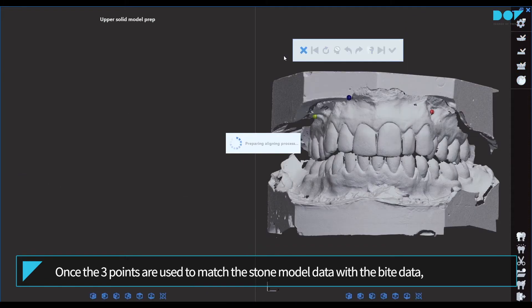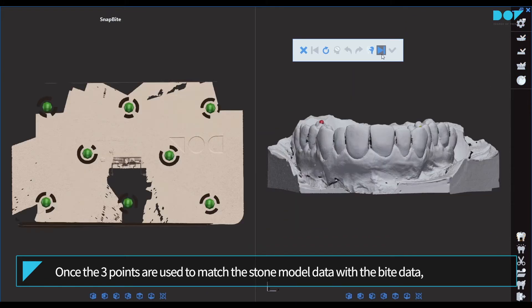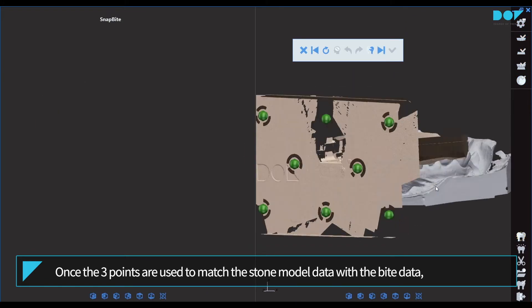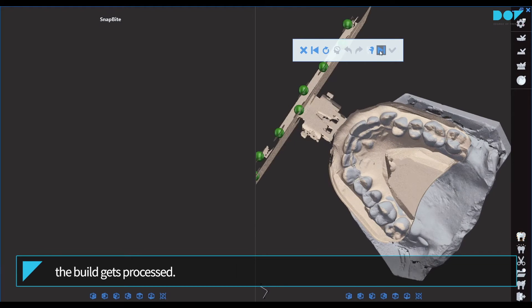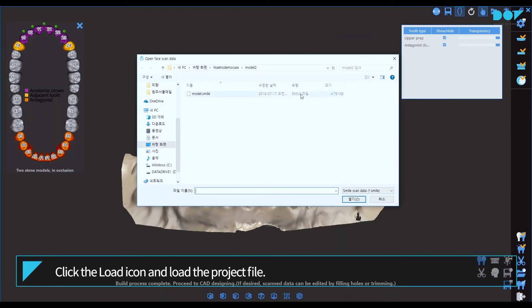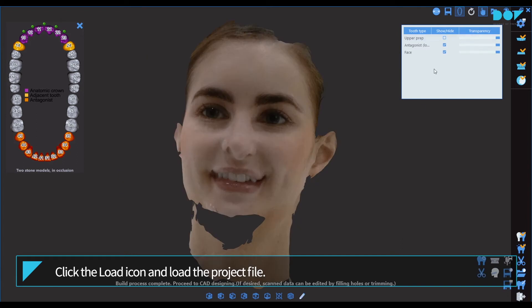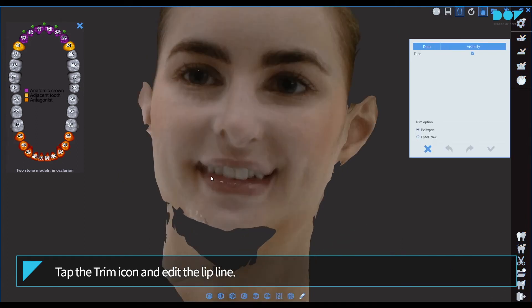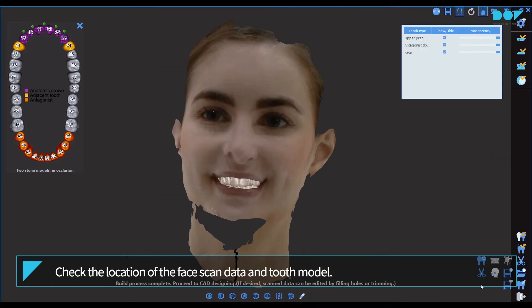Once the three points are used to match the stone model data with the bite data, the build gets processed. Click the load icon and load the project file. Tap the trim icon and edit the lip line. Check the location of the face scan data and tooth model.